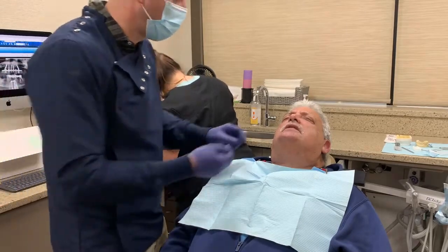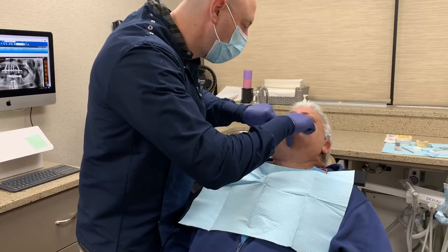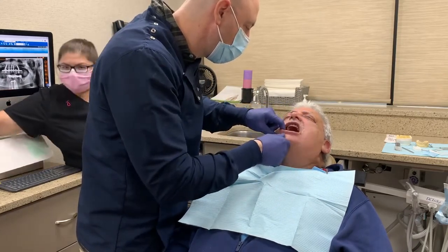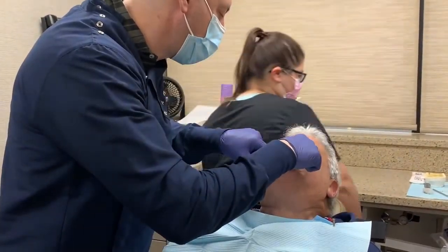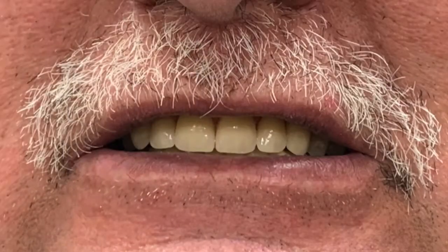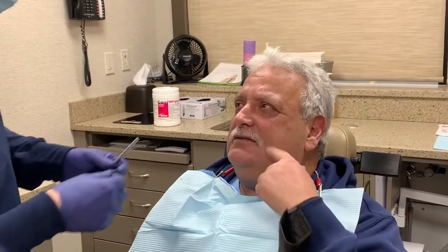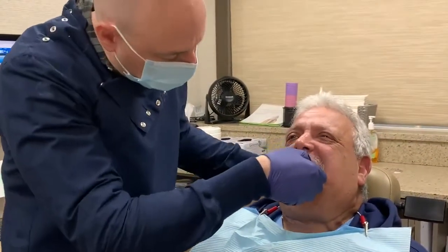Okay. And bite down. And bite on your back teeth, Jack. Your back here, on your molars. Open for me. Just relax your jaw and bite down. Try and bite on the back here. Yeah, there we go. Perfect. You want to come and take a closer look at here? You still feel when you bite down, you feel like it's hitting a little bit on that side? Yeah. Okay. Open. And bite down here. Oh, okay. And open.